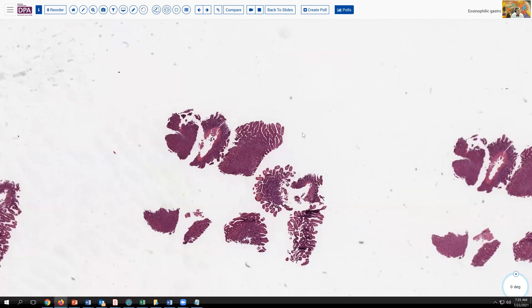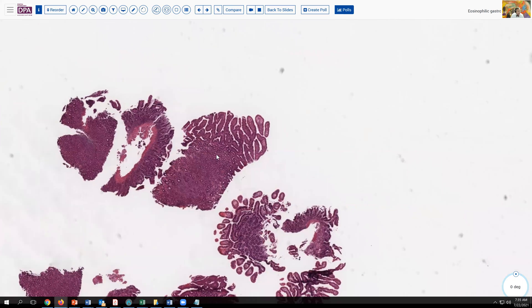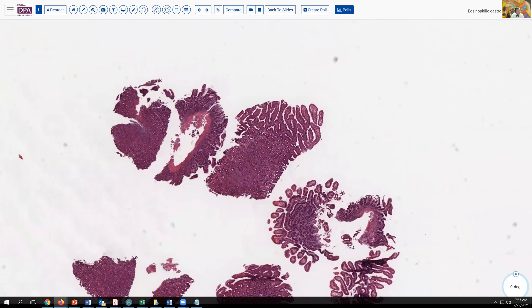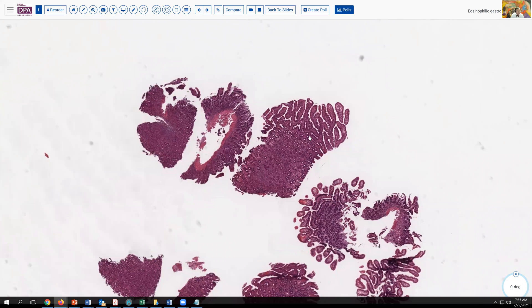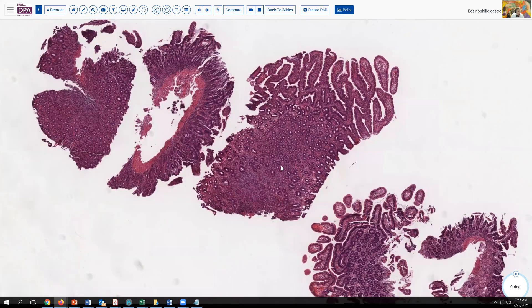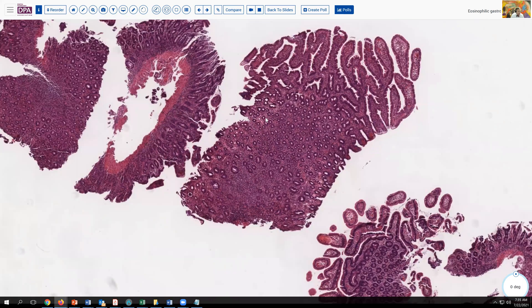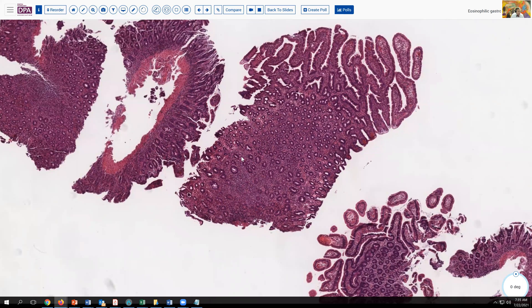At the time of the endoscopy, they find a few areas of erosive change. Here's one of them. This is a small bowel biopsy. We see the villus architecture here in several of these fragments. But notice that in this fragment, we're losing some of the architecture, and even though we're cut on a bit of a bias, we have some sort of erosive changes.